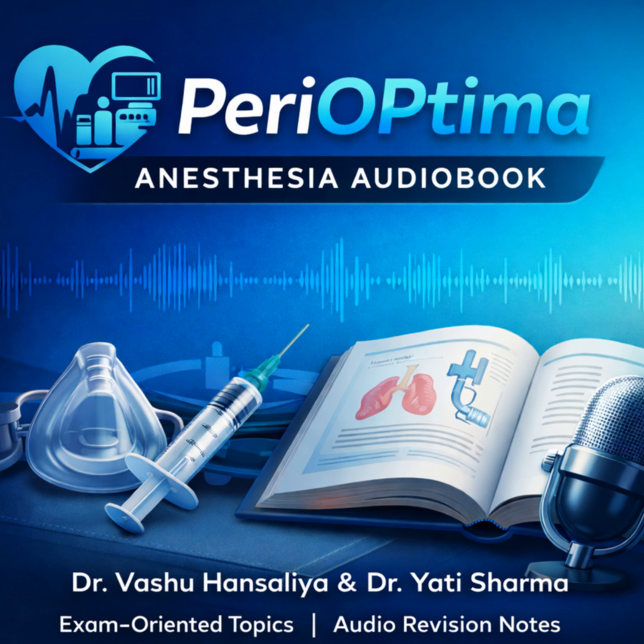Because it changes how you manage volume. You can't just drain the patient into the machine to fix hypotension from vasodilation, and the pump is very sensitive to preload. If the veins are empty, the pump sucks the walls of the vein shut. We call this chattering or suck down.